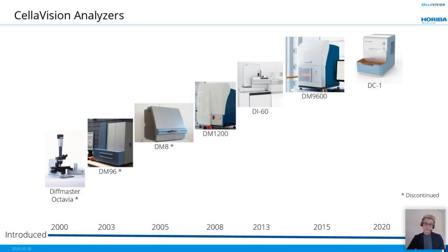It had a capability of loading 8 slides on a stage, so it had some sort of continuous feed. And then it came with a computer and software that the customers then reclassified their cells in. And it performed both a white blood cell differential and presented an RBC overview for the customer.